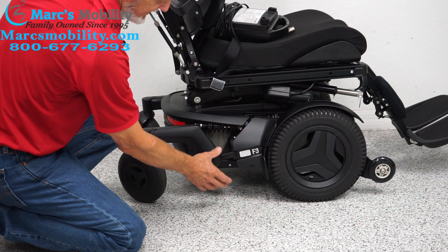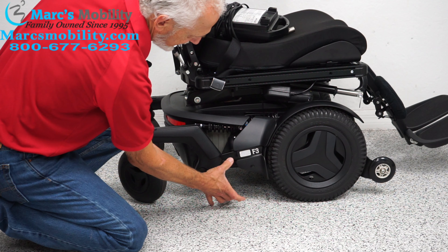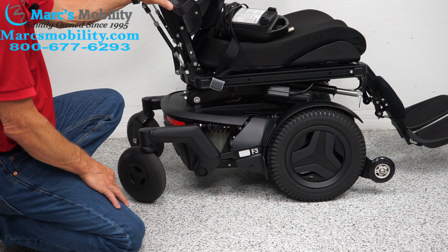You have a motor right here — you can't see it because it's behind the cover, but you can see the handle, which is the end of the motor. The motor starts here and goes all the way up to the middle of the wheel. No chain, no belts — direct drive from the motor to the wheel.